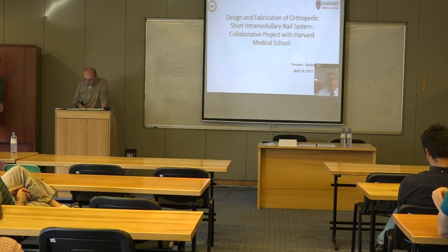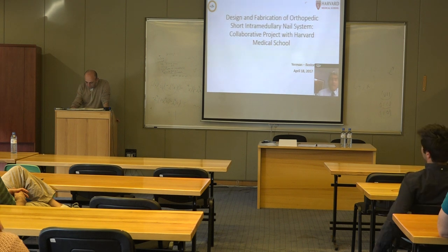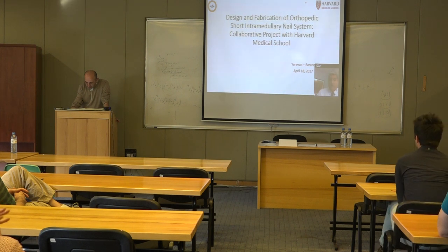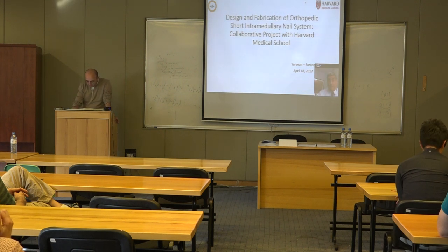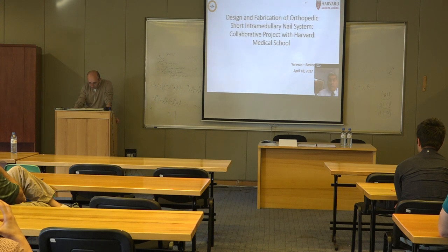As a part of the first, we follow the ASTM guidelines. ASTM specifies what kind of materials you can and cannot use in testing. And these materials are manufactured and tested to those standards by the companies that develop them. So the titanium that we used here is a medical grade titanium. And if we were to use stainless steel, what we use is also a medical grade material that has gone through rigorous testing. These are materials that have been tested. They are materials that are used for orthopedic implants, and these are materials that have shown little biologic activity in the human body. So this is something that the bridge has been crossed, so to speak, and we don't have to worry about. Okay.